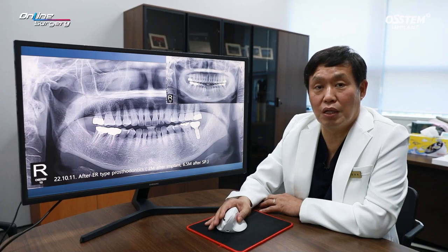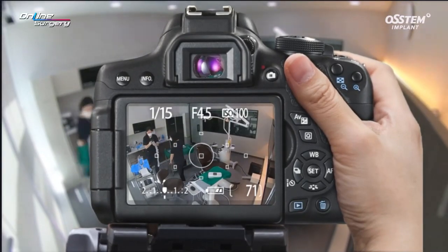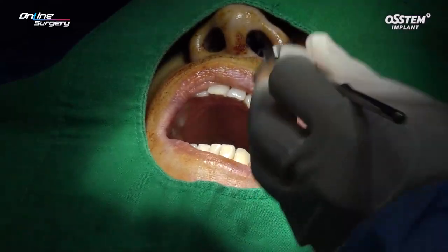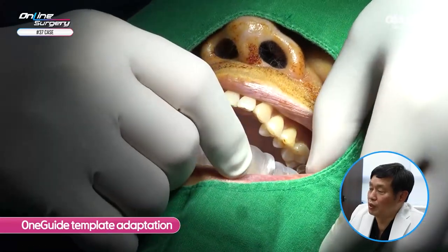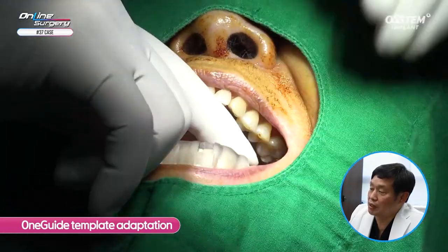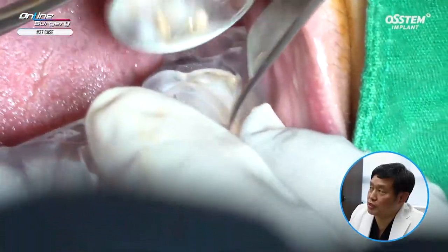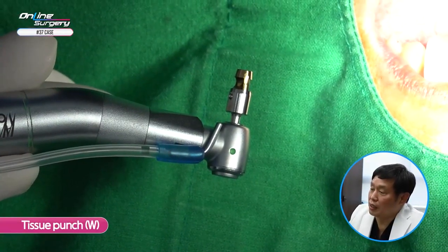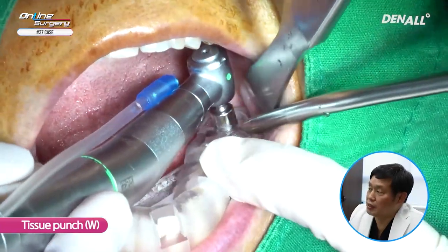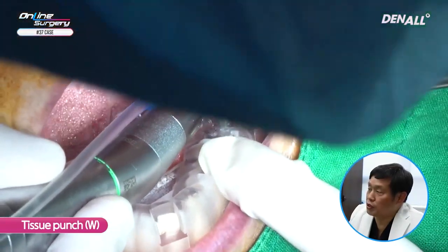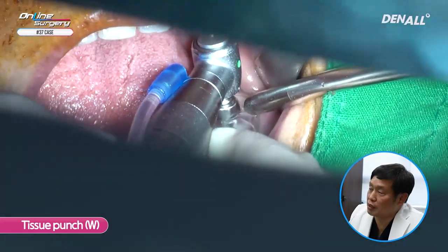Let's look at the surgical clip. As you can see, the one guide template is adapted and I'm checking the adaptation — it fits very well. If you look at the distal side of the mesial tooth, you can see that it is fitting nicely. A wide-type tissue punch is used to remove overriding mucosa. I'm using the tissue punch full length — there's no stopper on the tissue punch. Overriding mucosa is fully removed.